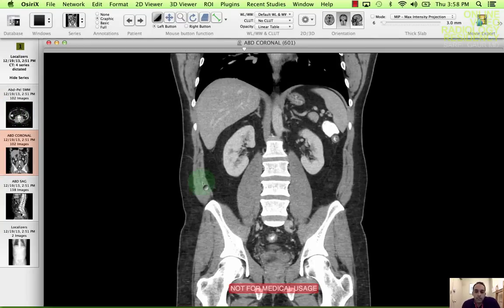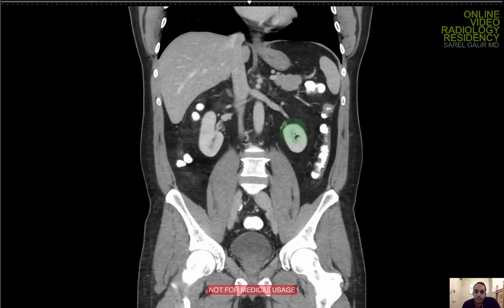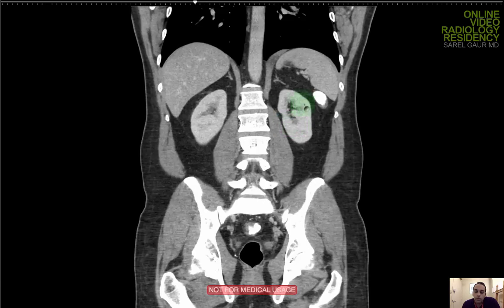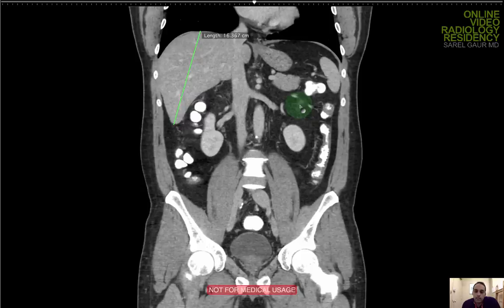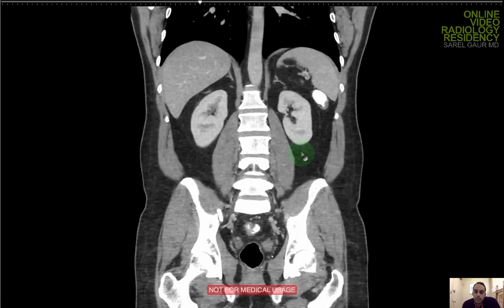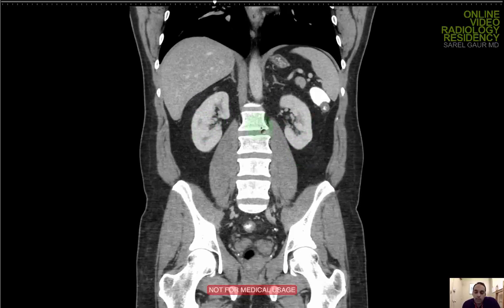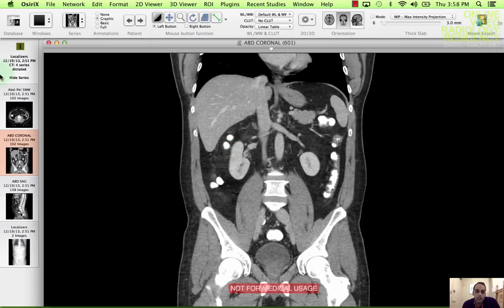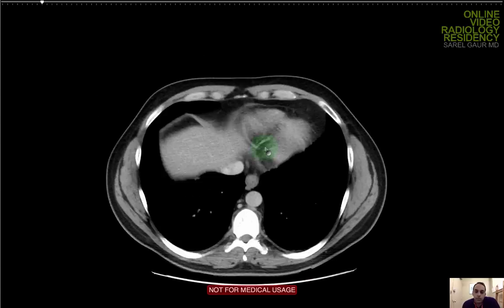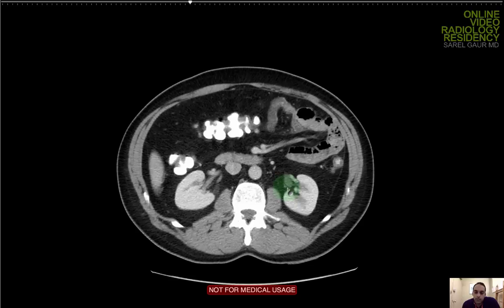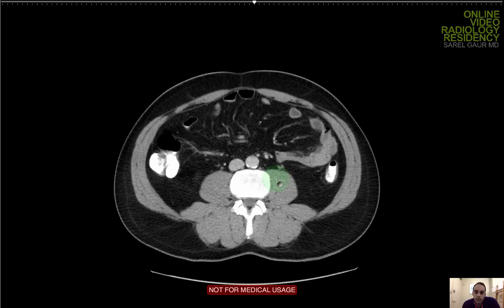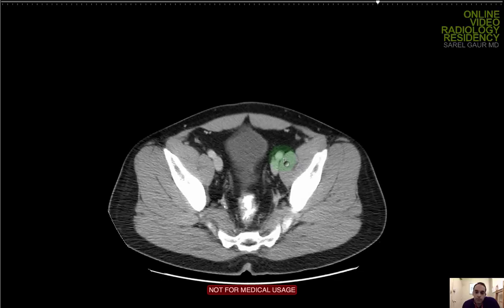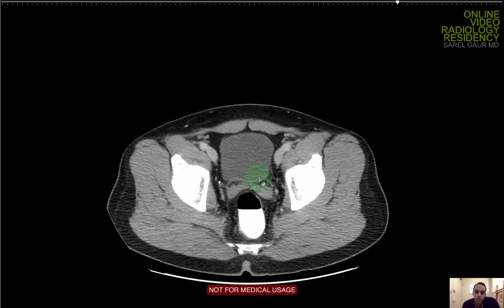Now I'm looking at the kidneys one by one, looking for hydronephrosis, any focal renal lesions — cysts or masses — and any inflammation around the kidney. I'm not seeing any of that. I'm looking for normal symmetric bilateral enhancement with the same contrast phase on both sides. Not seeing any hydroureter. Going to my coronal reformats now to follow the ureters down — the left ureter extends out of the left kidney and lays right on top of the psoas muscle, next to the spine. Looking at both ureters for any hydroureter or stones. I'm not seeing any.